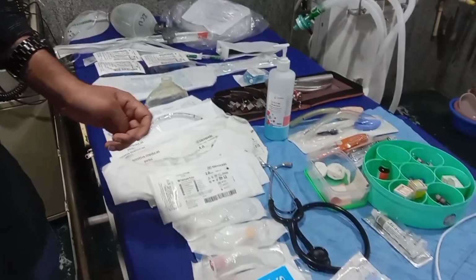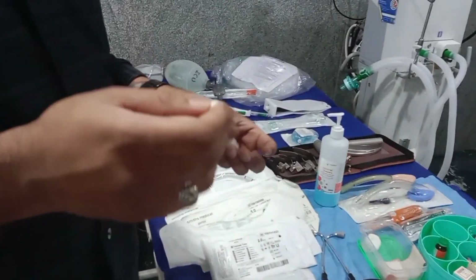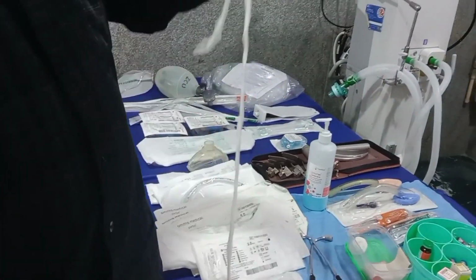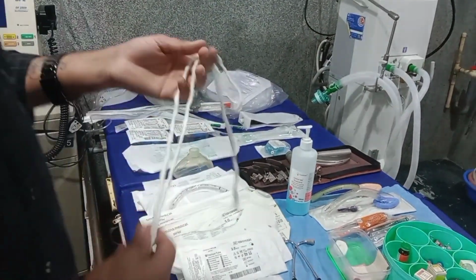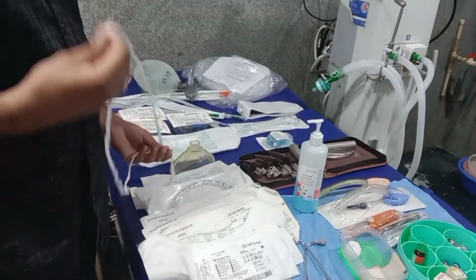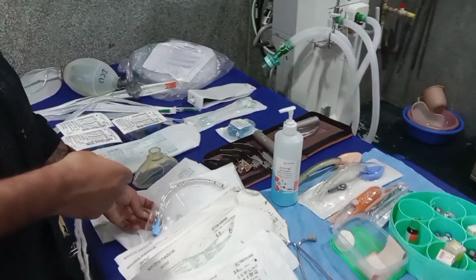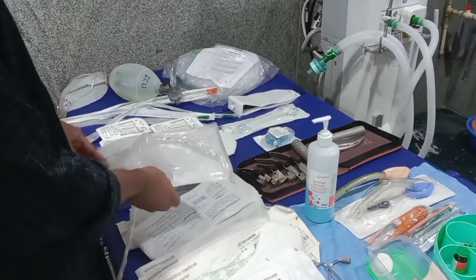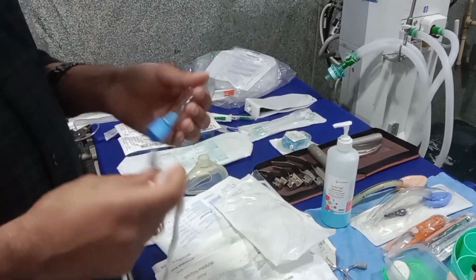After fixing the tube, we use this gauze thread to tie the tube around the patient. We use it like this. So this is the ET.